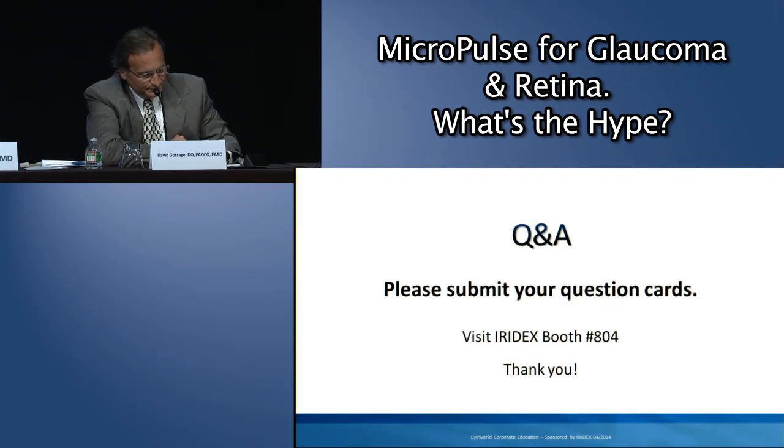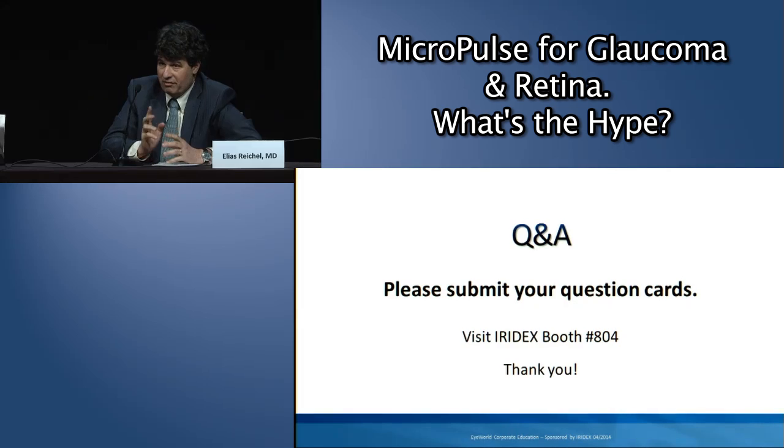Next question. Can you treat inside the foveal avascular zone? You can. The first case I showed was right in the FAZ, and no untoward effect. I think if you're starting out, I'd start at lower dosimetry, 250 milliwatts, and build some confidence. I've visited a couple of practitioners who are using this, and everyone seems very confident that starting at 250 is great, and actually people are moving up to, as David said, the 400 milliwatt range now.